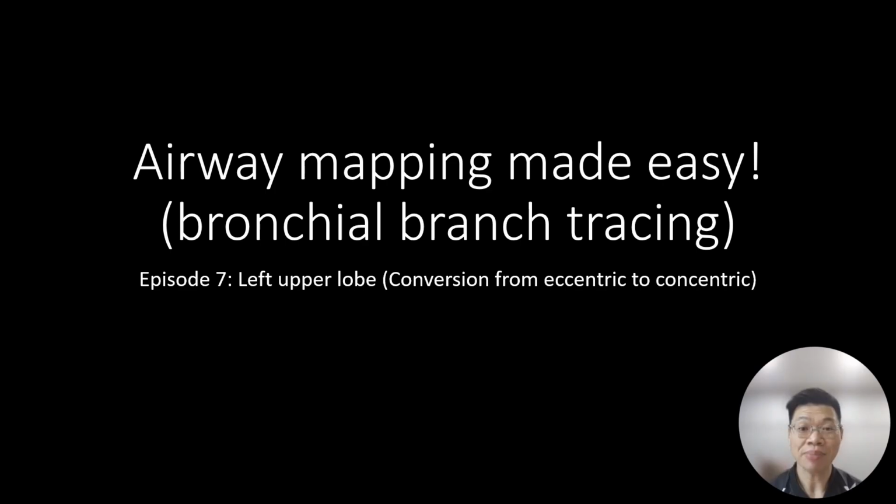This case will also highlight my approach to nodules, which are eccentric on airway mapping, and how we can convert eccentric nodules to concentric nodules for better diagnostic yield.